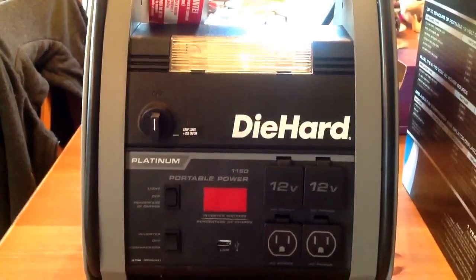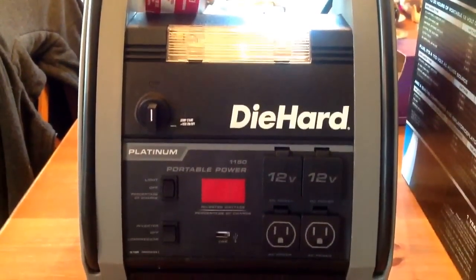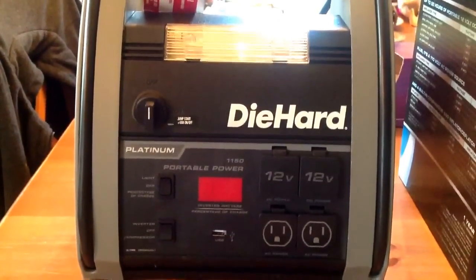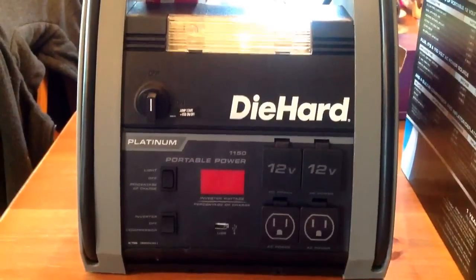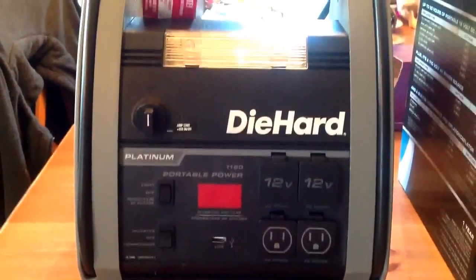And the reason I bought this is because I sleep with a CPAP machine, which is a machine that is used for folks that have sleep apnea. And what it does is the machine keeps your airways open while you sleep. Okay, so important things like you don't die happen.